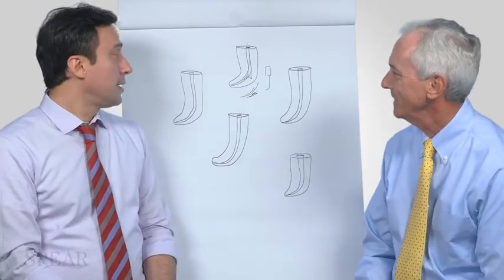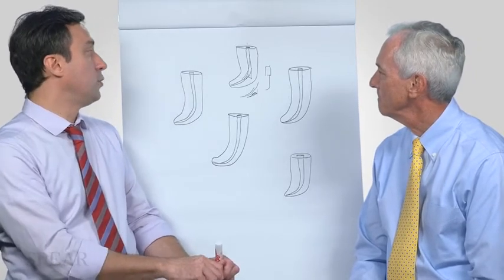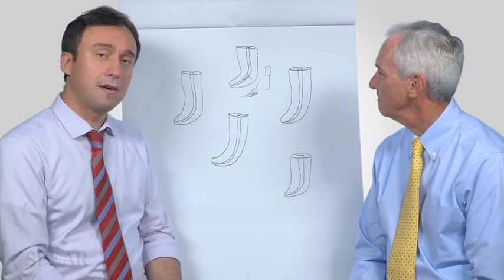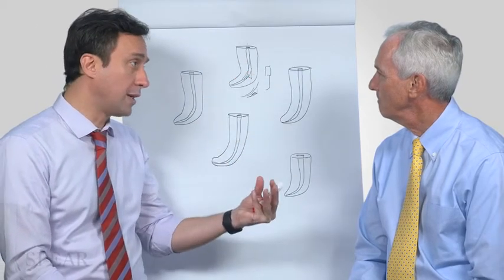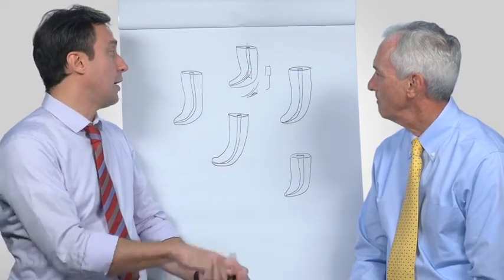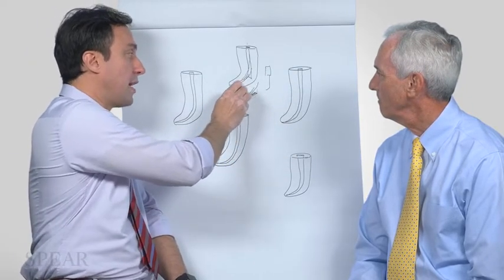Yeah, and it is difficult to deal with, especially nowadays with the NiTi files. It's tough to get around if you have a ledge. So the best is to first avoid a ledge. If you do get a ledge, using shape memory, you can pre-curve your NiTi file and get around it.